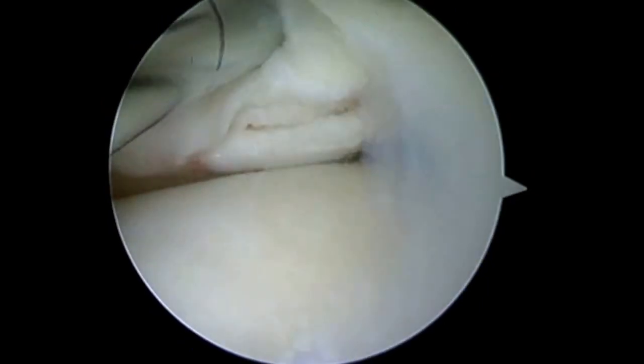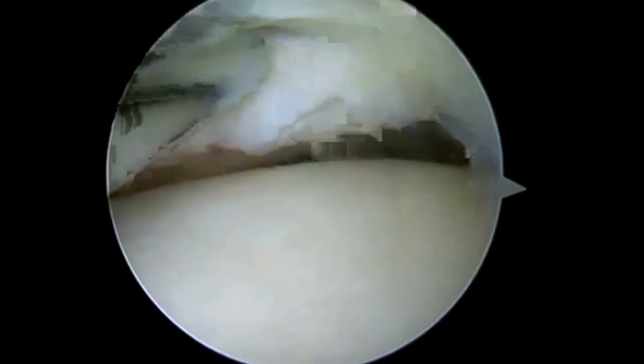Here we're looking at a very complex tear of the lateral meniscus. We've got a horizontal cleavage plane in our red-red zone. We've got two vertical splits in our red-white zone. And as we move over to the middle one-third, at the level of popliteal hiatus, we'll see another vertical split.